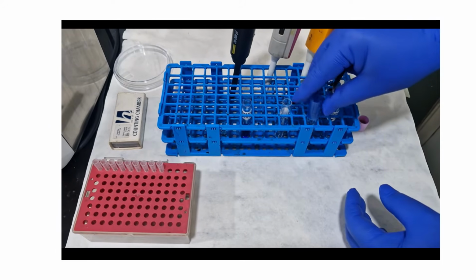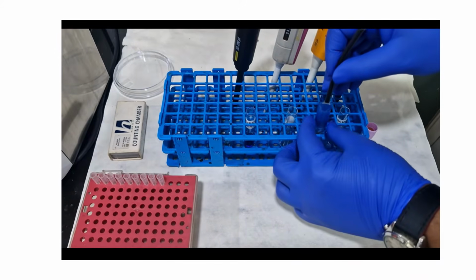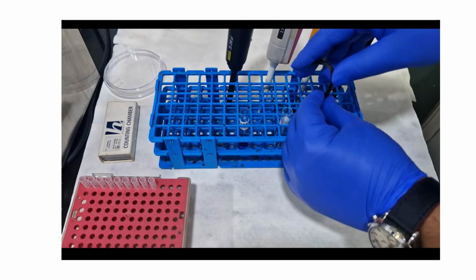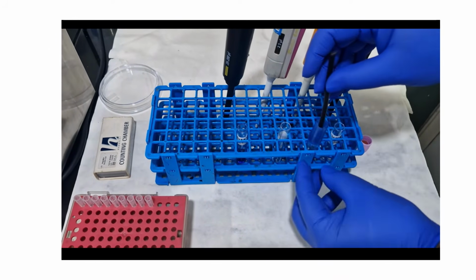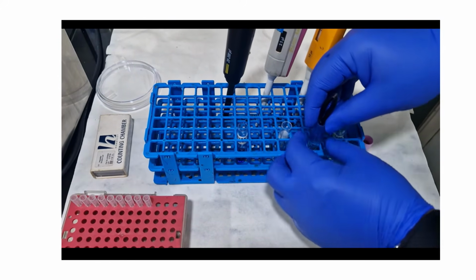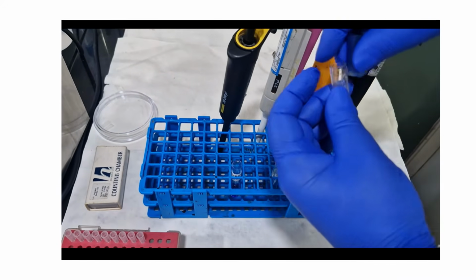Now we will be using a hematron segment device to collect a sample from the tubing of the packed red blood cell bag which we selected to conduct the experiment. Gently twist the tubing on the segment device to collect the adequate sample in a clean test tube.